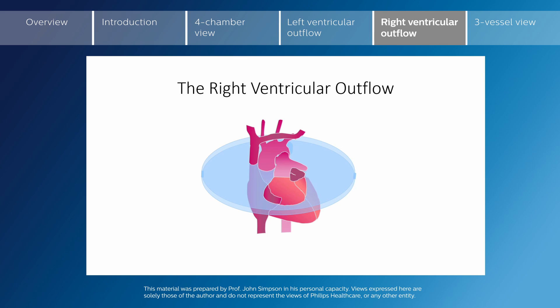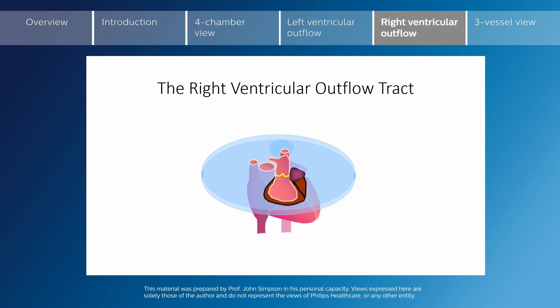As we scan more superiorly we will bring in the right ventricular outflow tract as shown here. The sonographic cut shows us the right ventricle anteriorly leading to the pulmonary valve, pulmonary artery and duct, which head in a virtually straight anterior-posterior direction. We can see the right pulmonary artery particularly easily in this plane as it heads behind the ascending aorta. Both the ascending aorta and the superior vena cava are shown in their short axis in these sonographic planes.